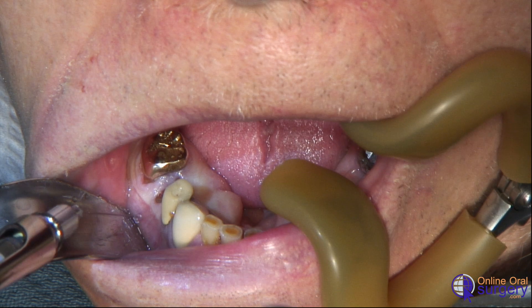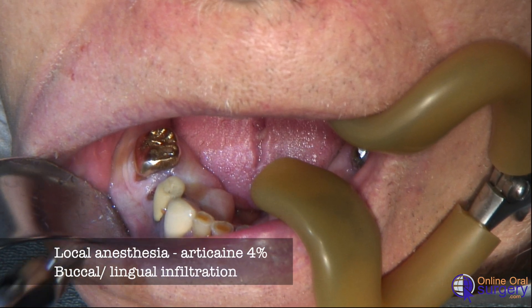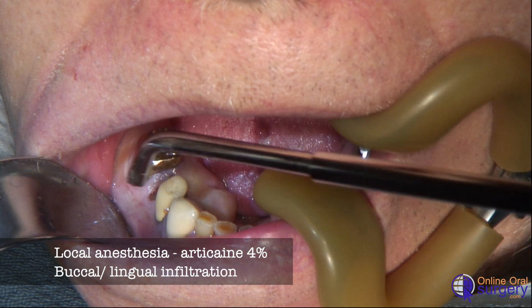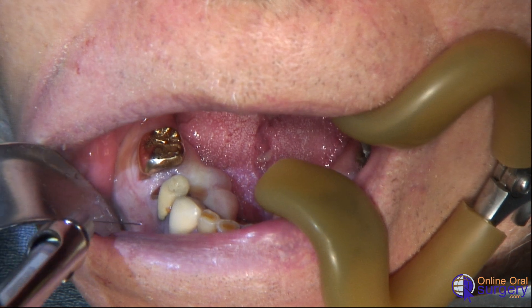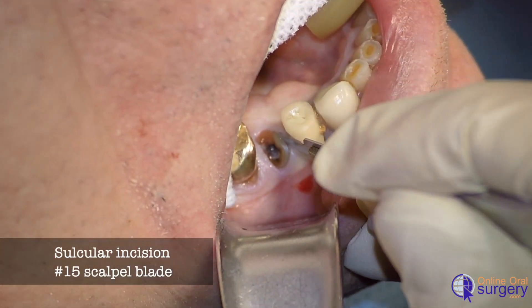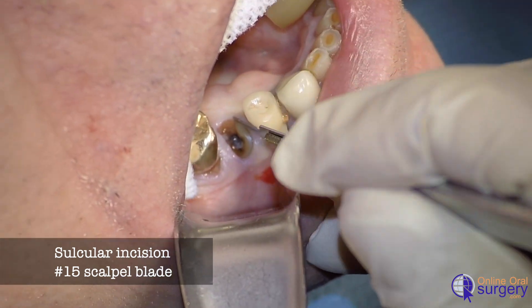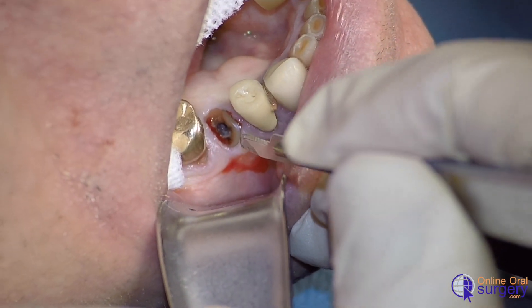Clinically, we can see that there is nothing above the gingiva. We're going to go ahead and give local anesthetic by infiltrating some 4% articaine into the vestibule on the buccal aspect of the alveolar ridge, and do the same on the lingual. After giving a couple minutes for that to take effect, I'm going to take a number 15 scalpel blade and make a sulcular incision mesially and distally as well as on the buccal and lingual to separate the gingival mucosa from the tooth.